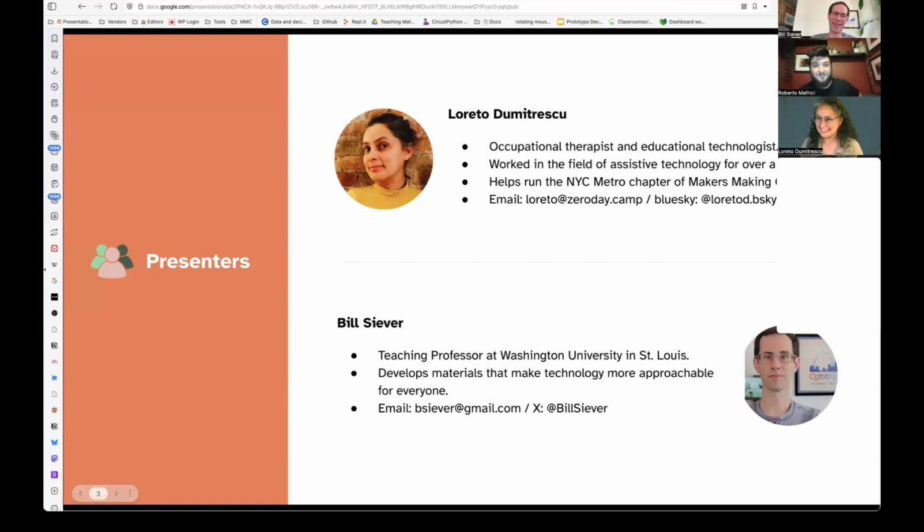Thanks, Loretto. Hi, my name is Bill Siever. I'm a teaching professor at Washington University in St. Louis. A lot of what I do is teach introductory computer science classes and things like Internet of Things, where you're trying to connect computers to the outside world in some way. I've also spent a lot of time working with this platform called the Microbit, this little thing. And I try to support K through 12 educators. One of the products of that, which I'll show you today, is something designed to make this easily able to control computers in various ways, acting like a keyboard or a mouse. So with that, I'll turn it over to Rob.